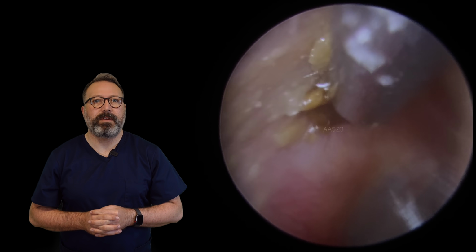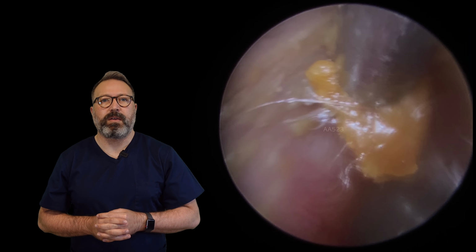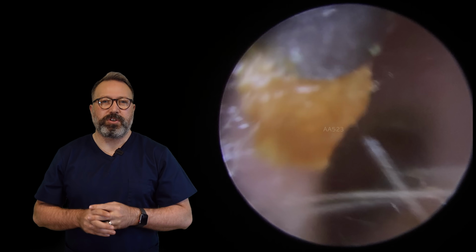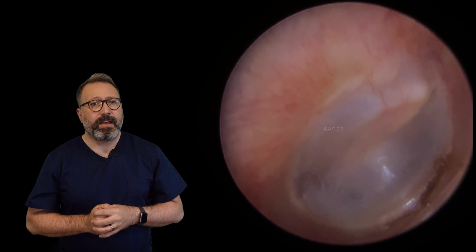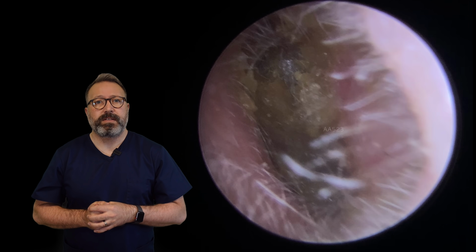Oh, you can see a little bit of blurring there from the olive oil. Is that going to come away? Oh, it came away really well, that piece. Lovely. Always a little bit more cautious when you've got to take one that's very close to the canal wall away. And we'll take a look behind that. There we go. There's the eardrum looking lovely and healthy. Let's have a look at the other side.